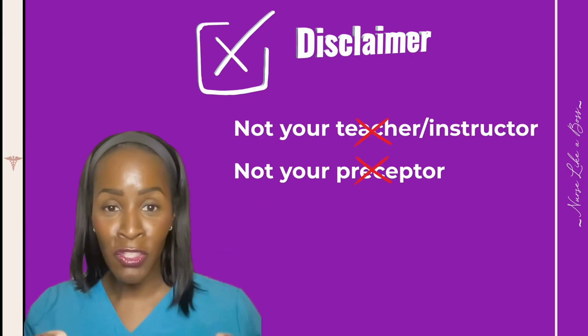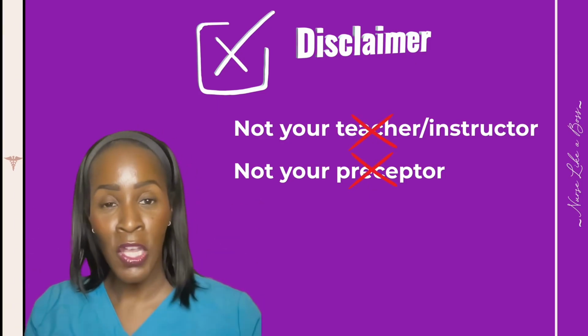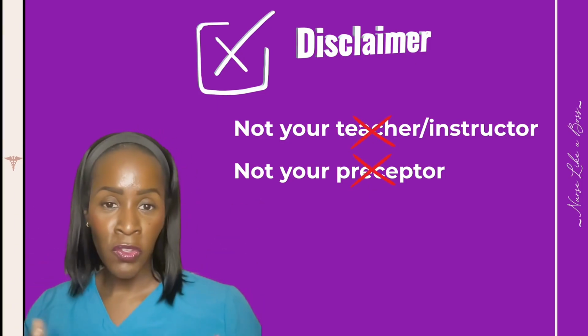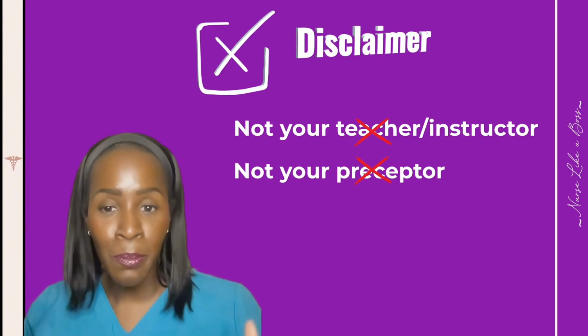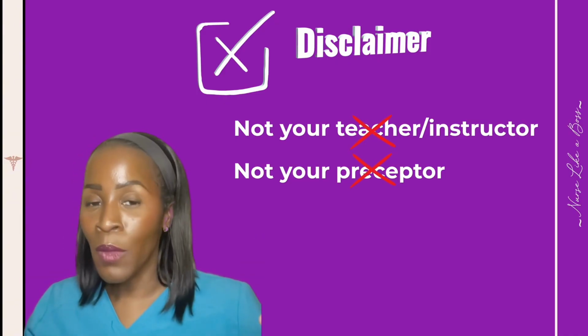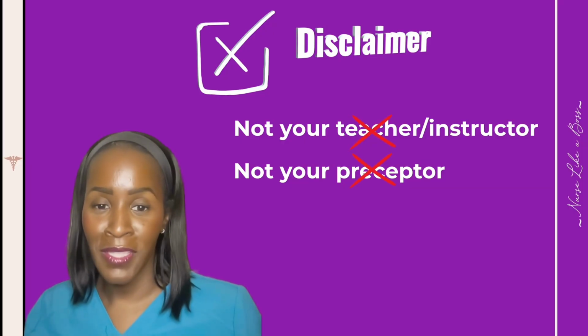But I'm going to teach you what I know because I have taught electronic fetal monitoring and I feel like I'm pretty decent at it. And I feel like it can be easy. And we're going to do that and make it easy for you today.